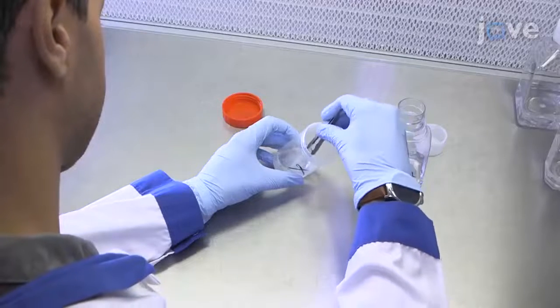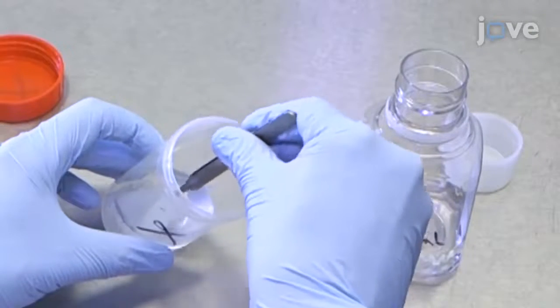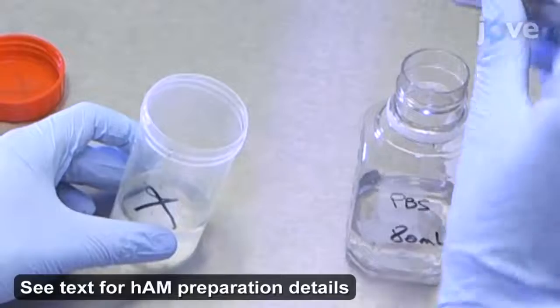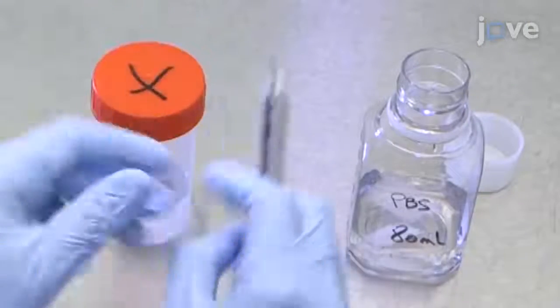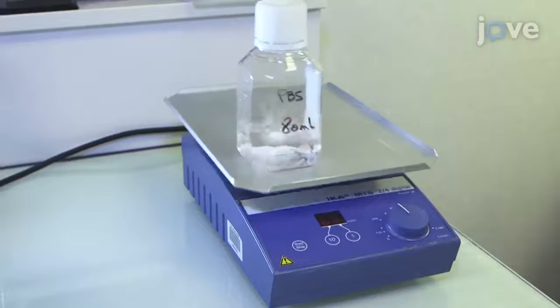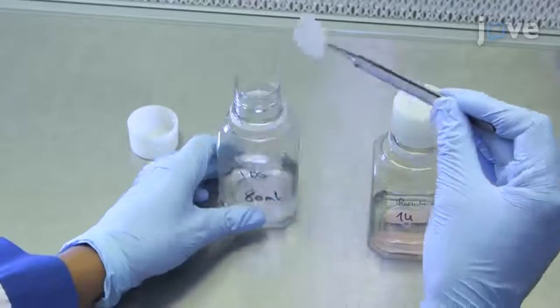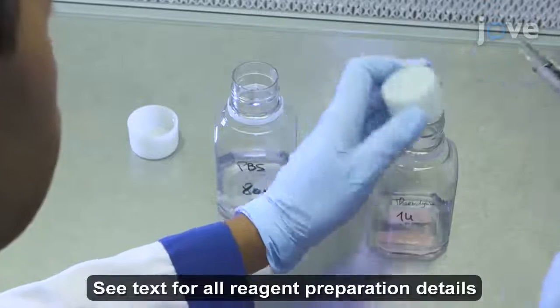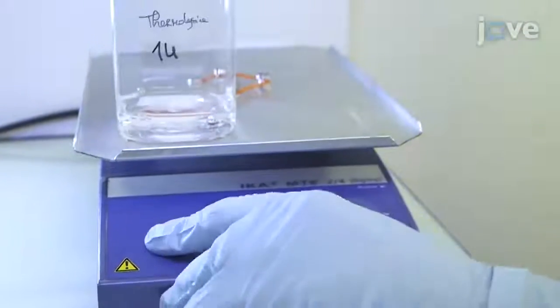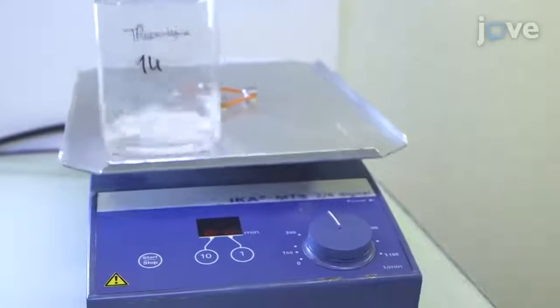Begin by washing 1 to 4 30 by 30 mm pieces of human amniotic membrane, or HAM, fixed in nylon scaffolds 2 times in 80 milliliters of PBS per wash in a 250 milliliter bottle on a shaker at high speed for 5 minutes. After the second wash, add 40 milliliters of working thermolysin solution to each bottle, and shake the bottles 2 times for 5 minutes at 450 RPM, followed by 30 seconds of vortexing.